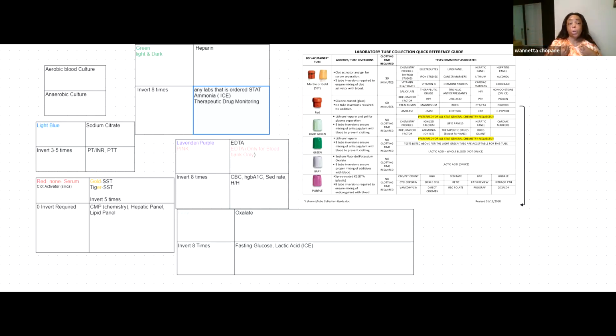So if I was the actual medical lab technician, and you brought the green tubes to me to be resulted, I know that some of those must be stat. Okay, tell me if I lost you. So the green top tube is not an SST tube, it's a heparin tube. But the same test that goes in the marble and gold top tube, the SST tube, can go in the green, but it's only because it's stat, immediately, ASAP.